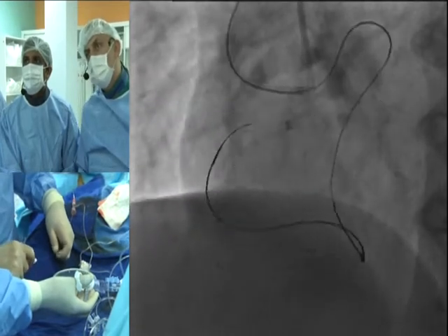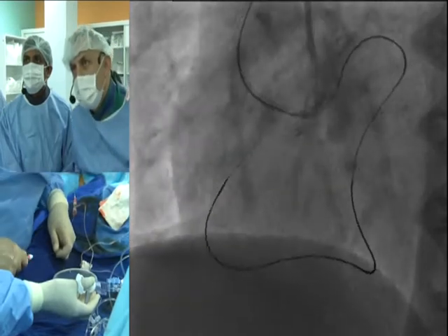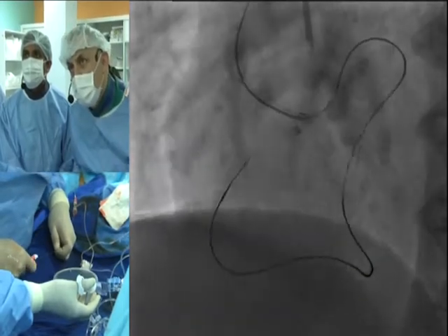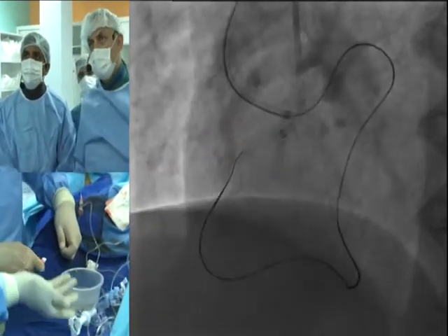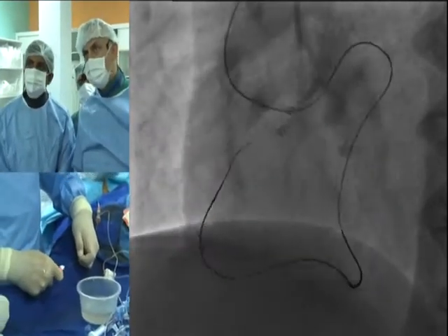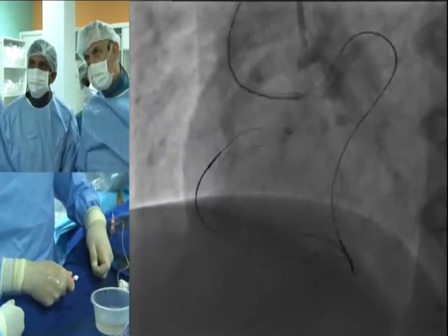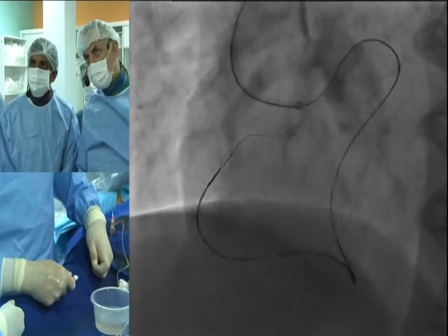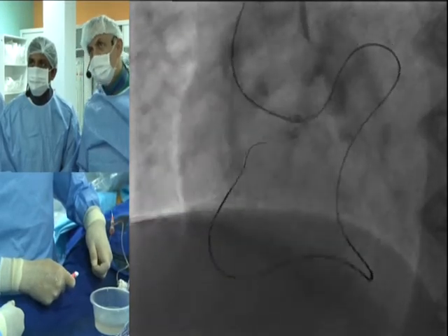Okay, so I think what I can do, I can have now here. Would you use a Pilot 200 in this scenario? Not here, because I have to have something I could torque. In Pilot I cannot much. And I have already subintimal space there.